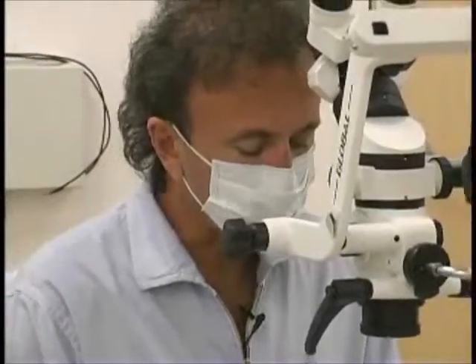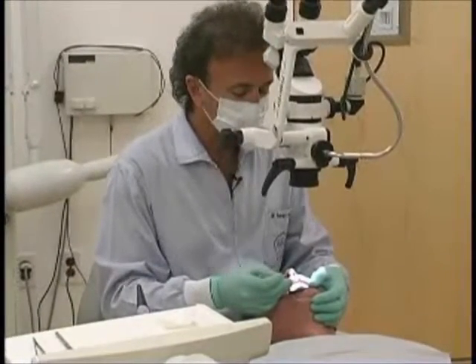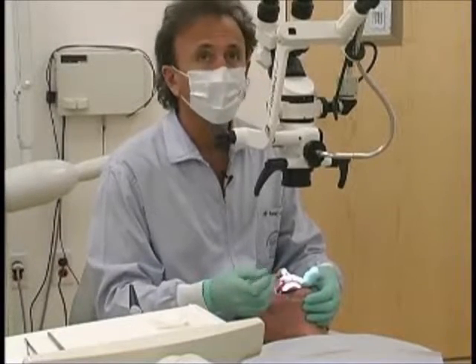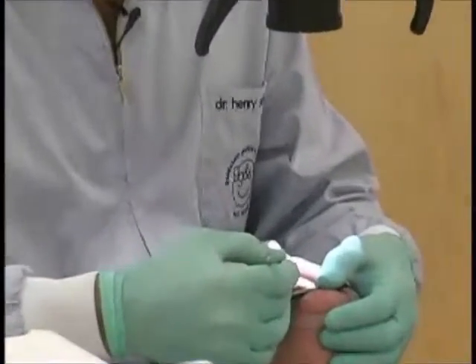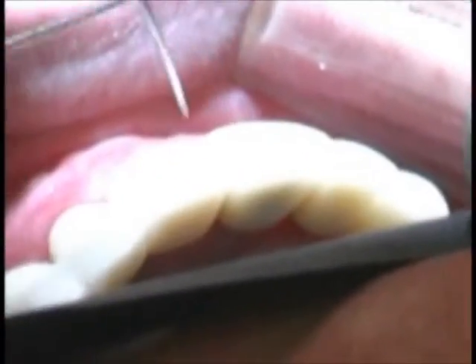Post-op, you can see that the tissue is healed really well. And we have not only a zone of keratinized tissue in this area, but also the volume is very comparable to the right central incisor in this area. If we look at it from pre-operatively, which was about 1 millimeter of difference from the adjacent central incisor, we've been able to maintain that same difference. So we've been able to preserve the original level.